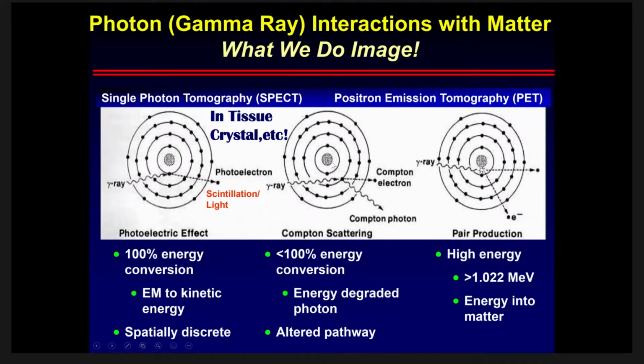So we'll talk more about this, but Compton scattering is a major problem in nuclear cardiology in terms of reducing spatial resolution.